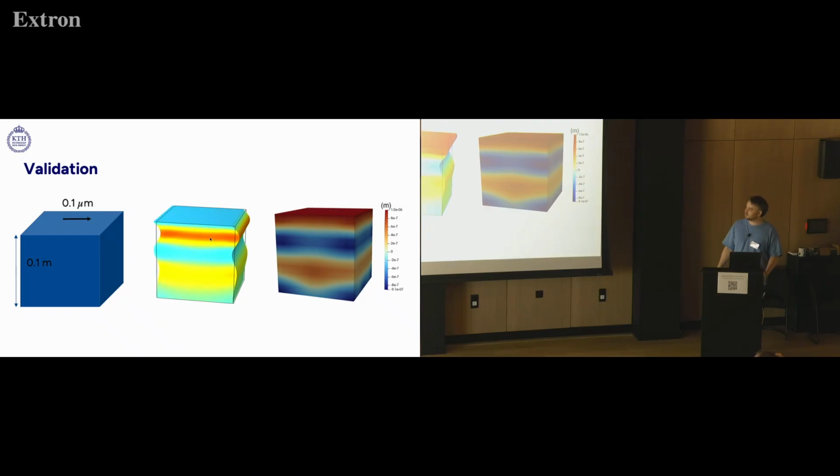What I've done thus far is validating the forward simulation with COMSOL. And it's just normal phantom geometries. I don't want to confuse you with this cute little GIF. There is no time axis, so the one to the right is the actual data.